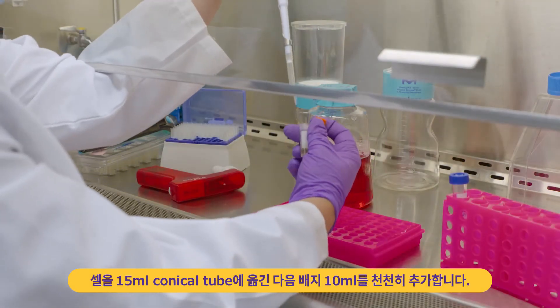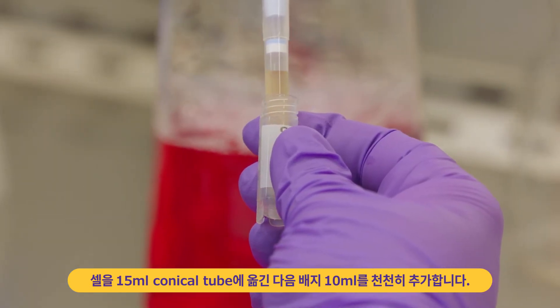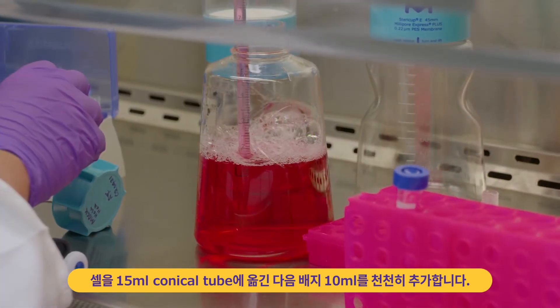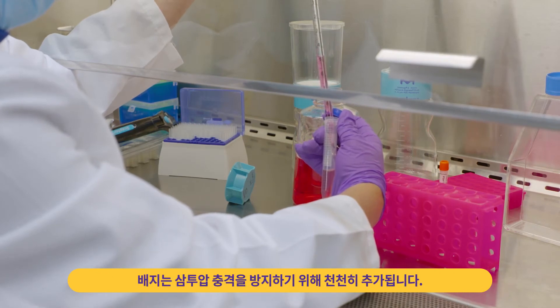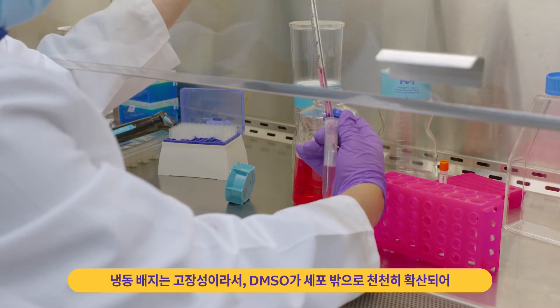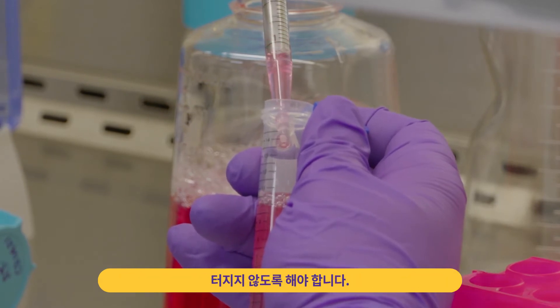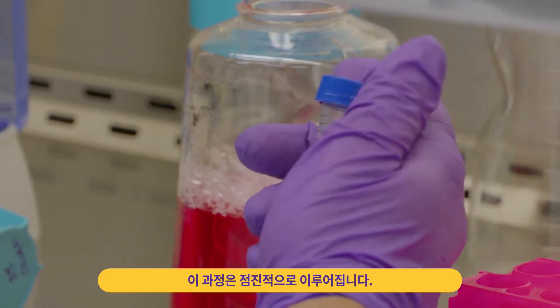Transfer cells to the 15 milliliter conical tube. Then slowly add 10 milliliters of culture media, dropwise, to the tube. Media is added slowly to prevent osmotic shock. Freezing media is highly hypertonic, so the DMSO needs to slowly diffuse out of the cells to prevent bursting. This is accomplished through gradual equilibration.